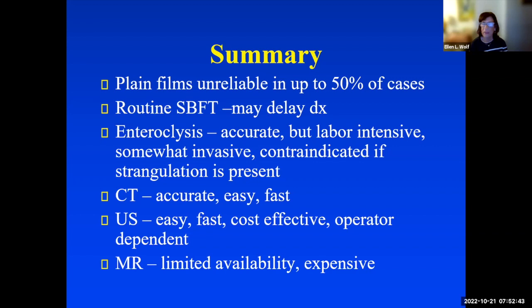Differentiating ileus and small bowel obstruction can be very difficult, especially in the postoperative patient, where some will actually have small bowel obstruction. So that's really the main pitfall. And again, those non-diagnostic cases where there's a gasless abdomen, that sort of thing, can be problematic as well.